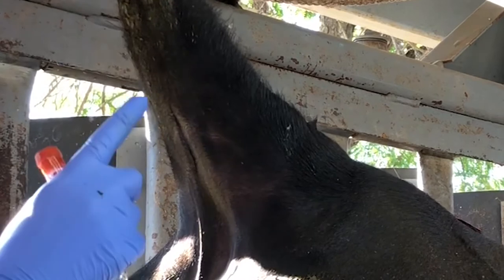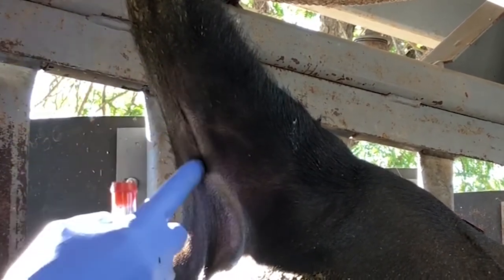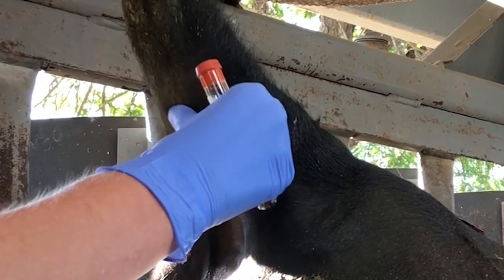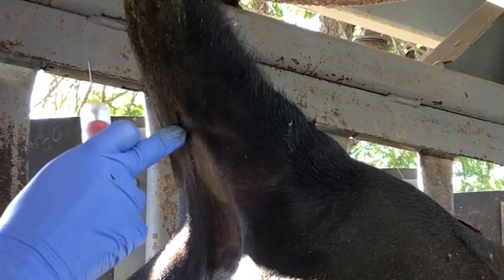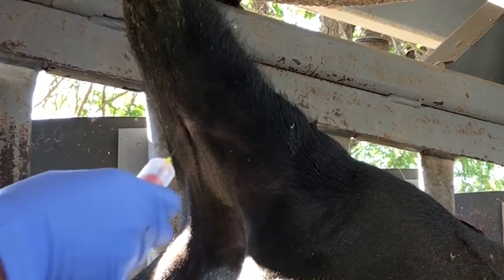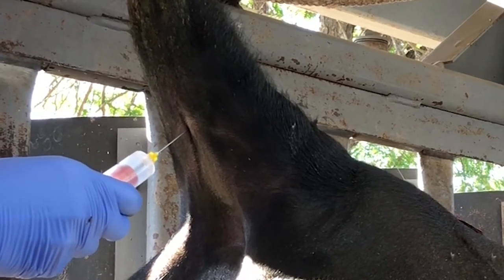Here's another view. Again, here is that midline groove and you can feel a vertebrae right here. What novices sometimes do, the mistake that they make, is they go in at an angle. Do not do that. You want to go in straight at 90 degrees to the tail.